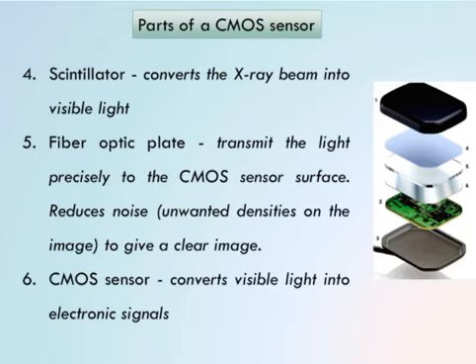That means the unwanted X-ray beam penetrating the sensor or unwanted visible light that is getting scattered and which can cause non-uniformities in the sensor. Okay, so these non-uniformities which can affect the quality of the image, these are called noise or radiographic noise.